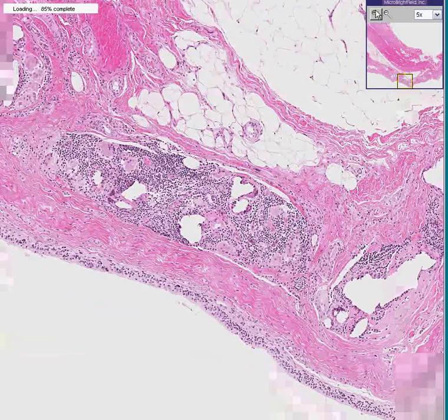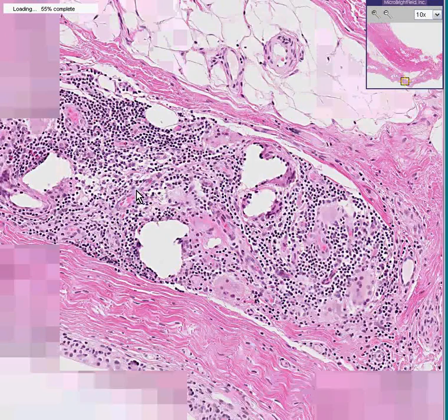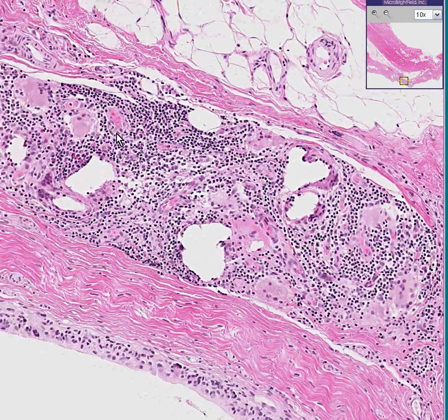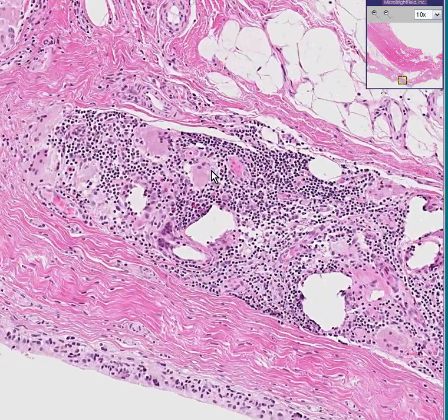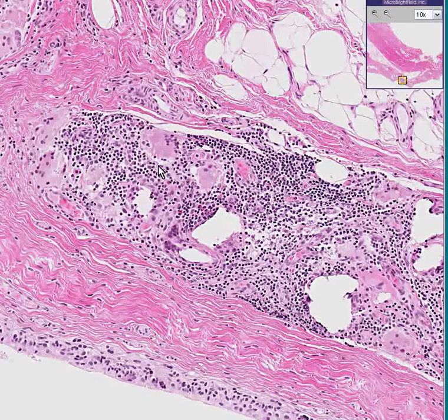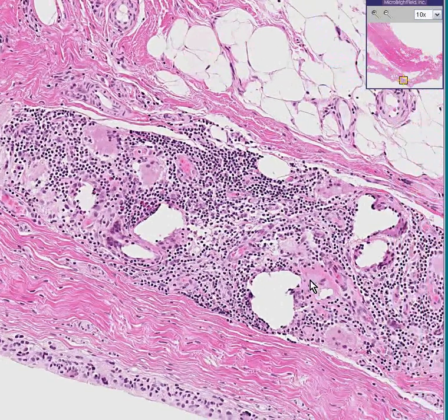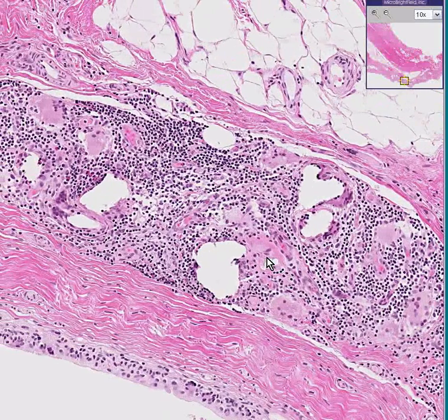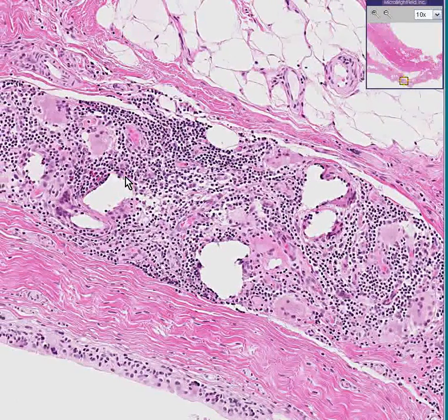In addition, we could see that there are abundant multinucleated giant cells. On the basis of this, is this a granuloma? Yes, it is — it could be called a granuloma. But in this case, the histiocytes have banded together to attack particles of material, perhaps infectious, perhaps foreign body, in hopes to dissolve and digest and destroy this tissue.